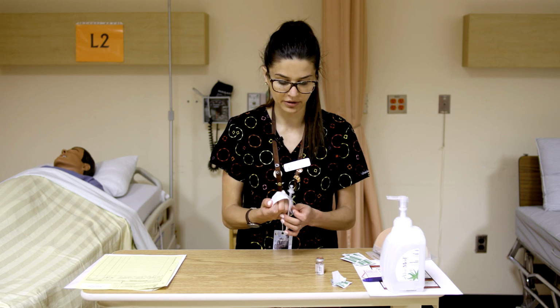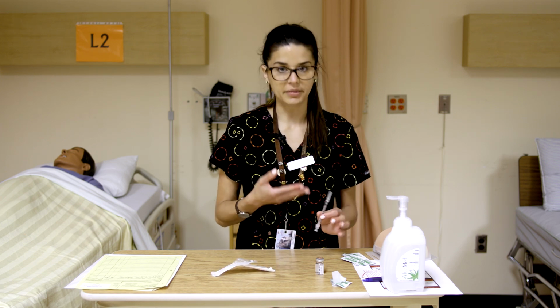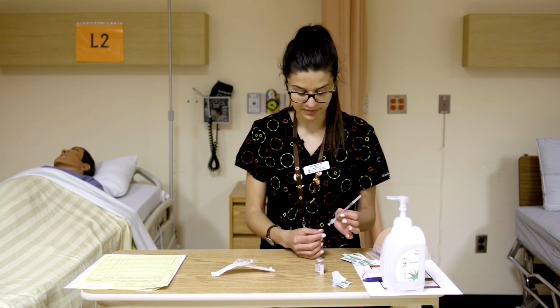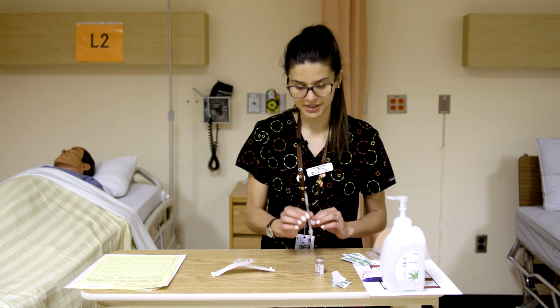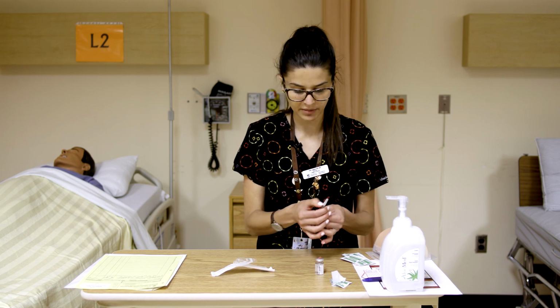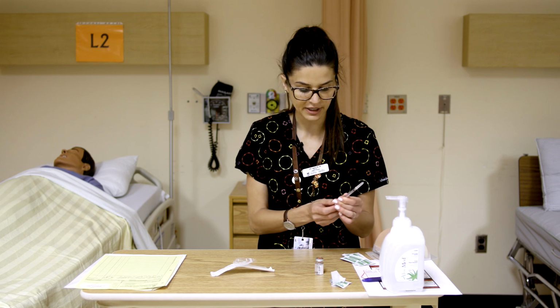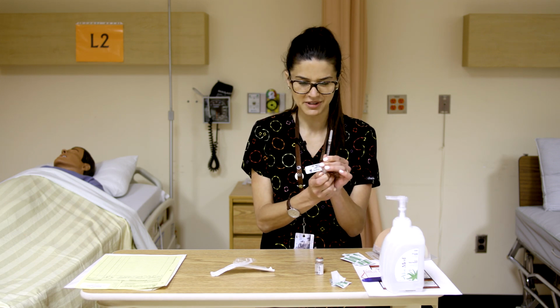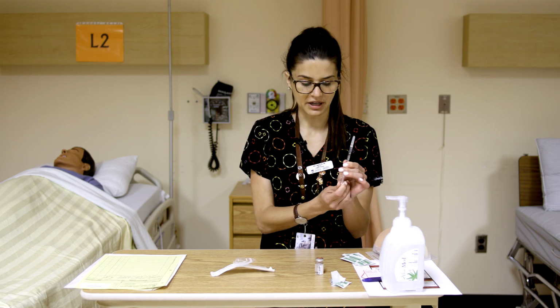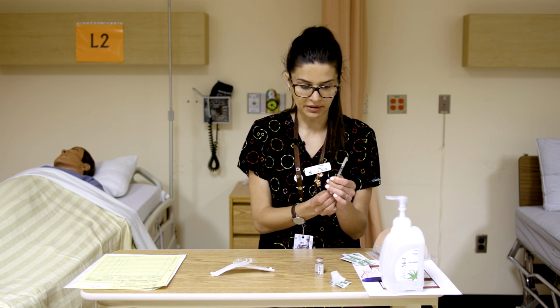We're going to peel it back, open it, again making sure not to touch any parts of it that are intended to be sterile. So really where you want to touch for the most part is just around the barrel of that syringe. We want 0.1 mL, so I just like to look at where that is on my syringe before I go for it. And like I said before, sometimes you just want to move that plunger up and down a little bit because it can be a little bit sticky at first.